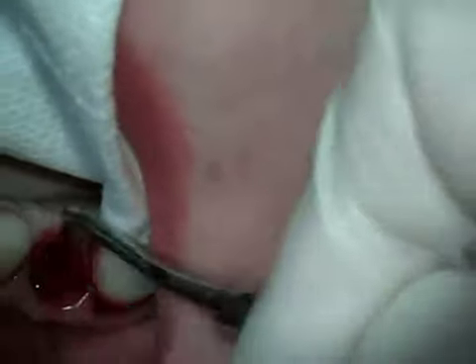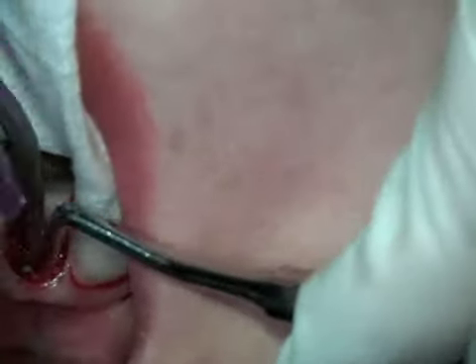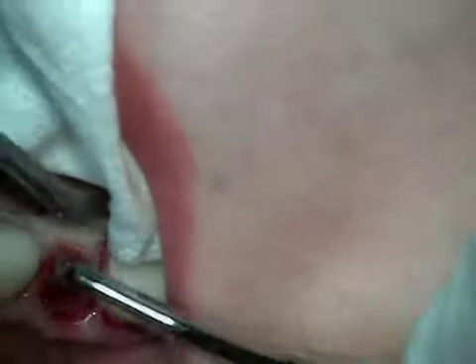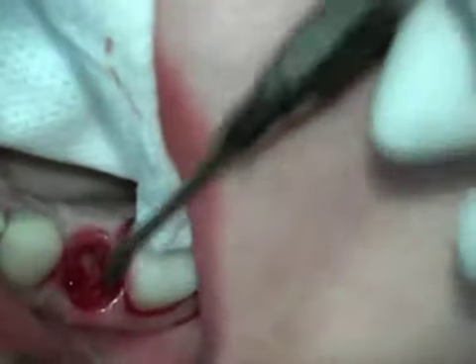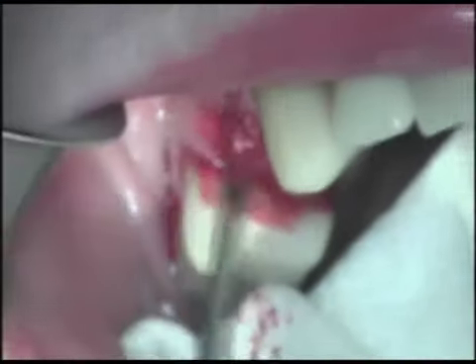And so when I go in now, I'm using a spoon curette. This is a Molt angled curette, and I'm going to get into the socket, and I'm going to thoroughly debride the socket as much as I possibly can. My goal is to get rid of all soft tissue that I can see and feel, so that when I go in with a curette, I'm feeling good, healthy, solid bone all the way around the socket. If there's any granulation tissue at the apex, I'm going to remove that also.